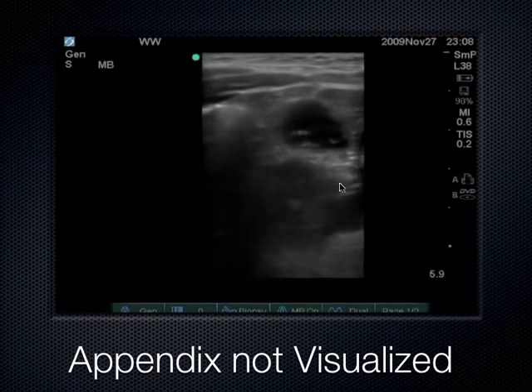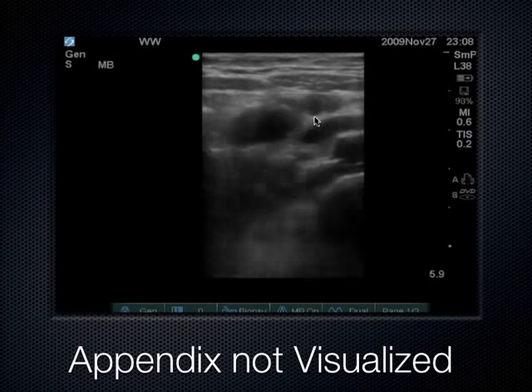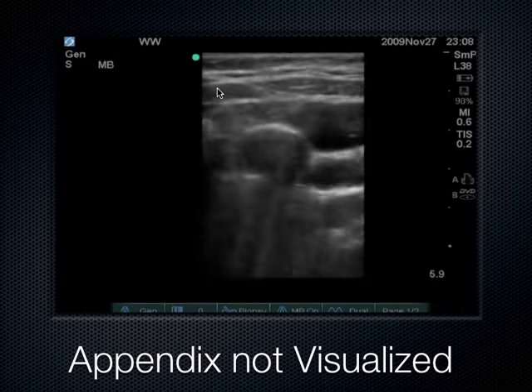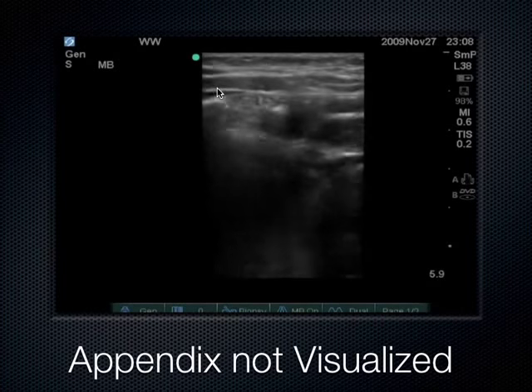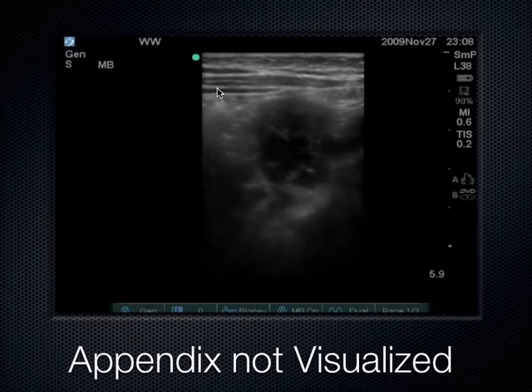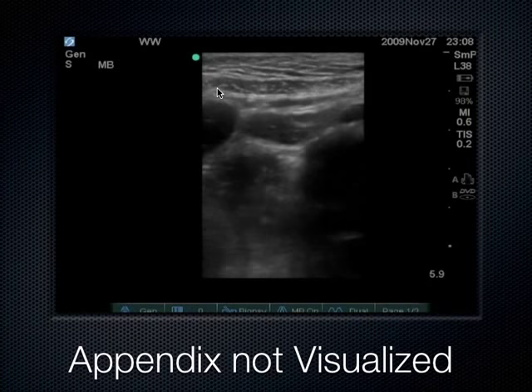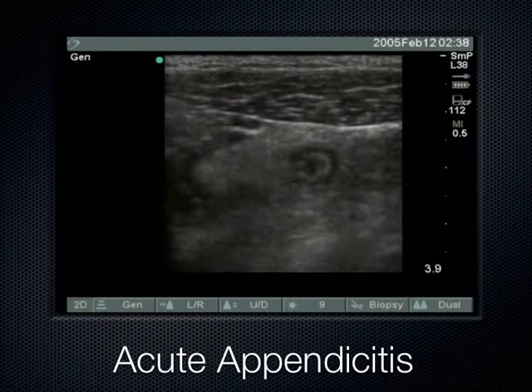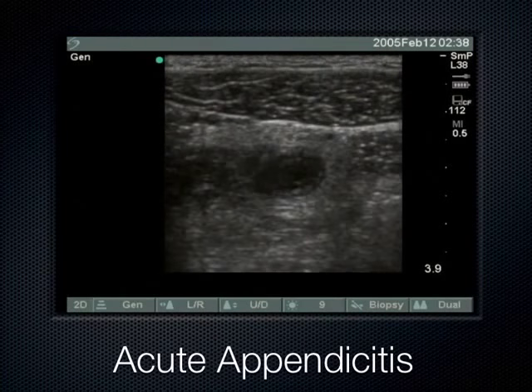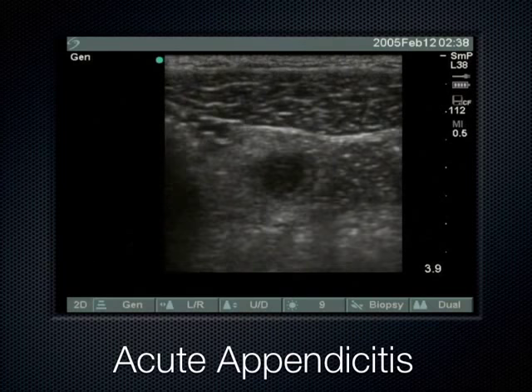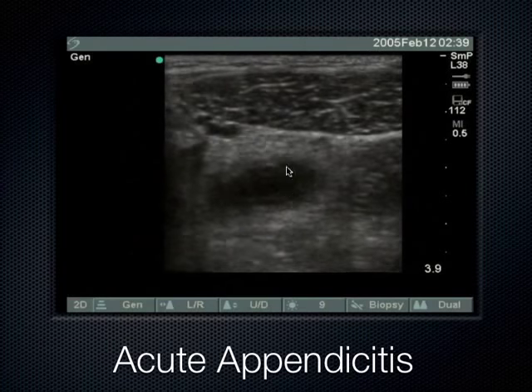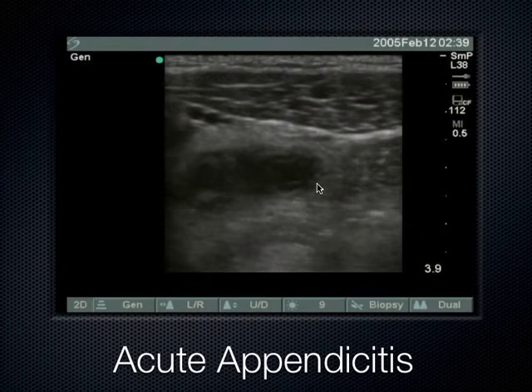Here's another case of clear acute appendicitis. We can see the non-compressible tubular structure down in the right lower quadrant — about 8 millimeters in this case. It's a sausage-like structure seen down here. Here's another example: the psoas muscle is visible, and there's a non-compressible tubular structure. Notice this hypoechoic surrounding area — that's the outer wall. That's how intestines look all along the GI tract.